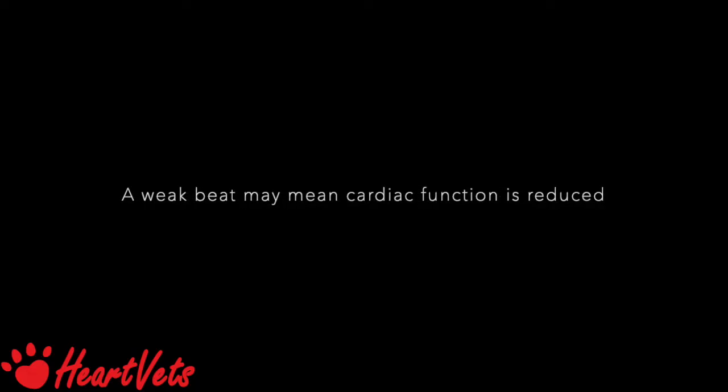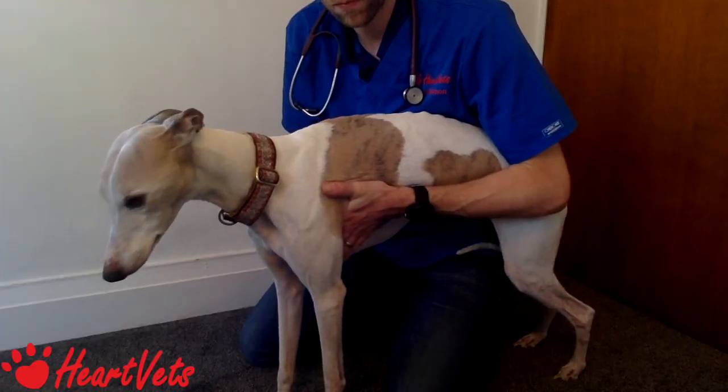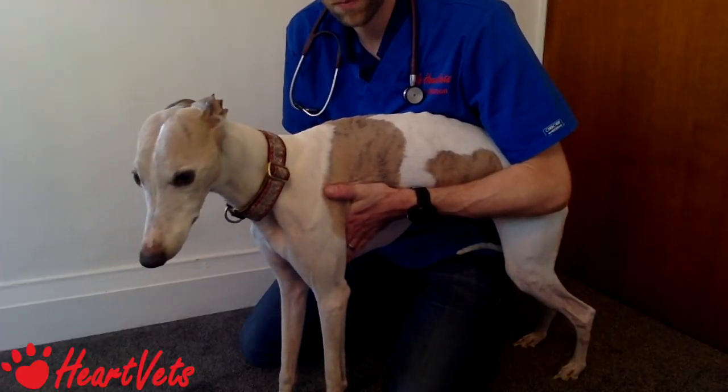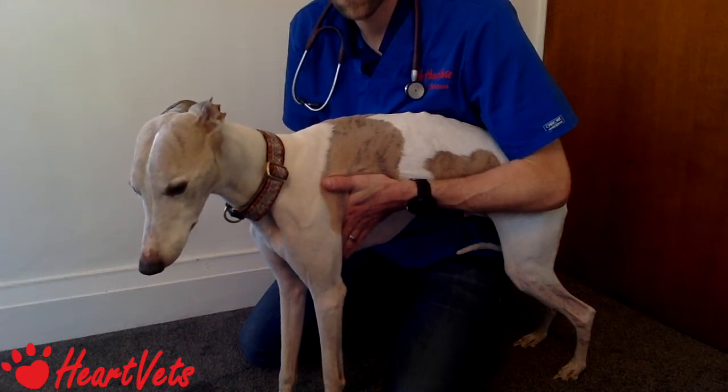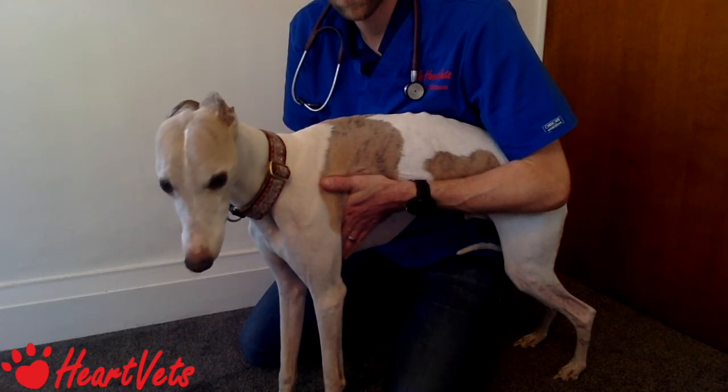Feel for any thrills or vibrations. If you feel a thrill, put your stethoscope head there first, as that is probably where the murmur will be loudest. Remember to palpate both sides carefully.